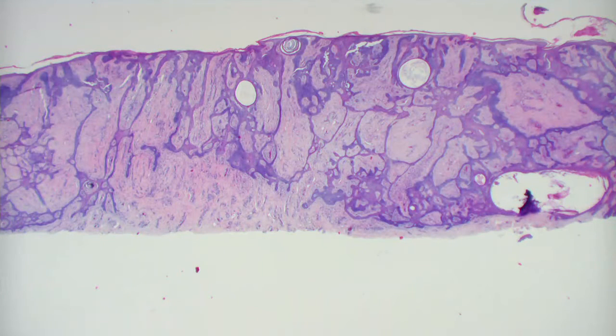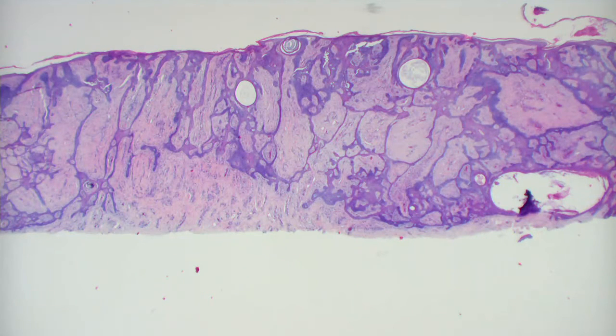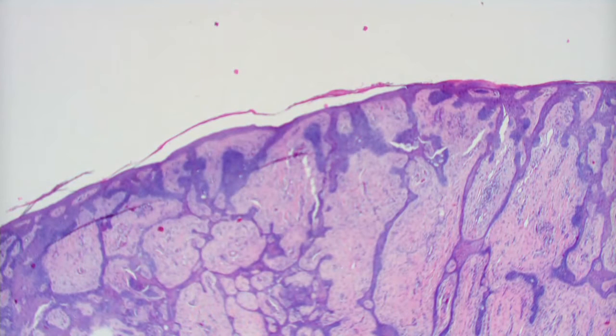So is there anything else that has an anastomosing epidermis? Is there anything else in the differential? I thought there was something else. There's one other one, but not usually to this degree. Tumor of the follicular infundibulum can give you some of that same thing. Okay. But usually that's pretty much confined to just these areas up here. It's very superficial. It doesn't really extend down this deeply. You usually don't get these really thin anastomosing cords in that condition.